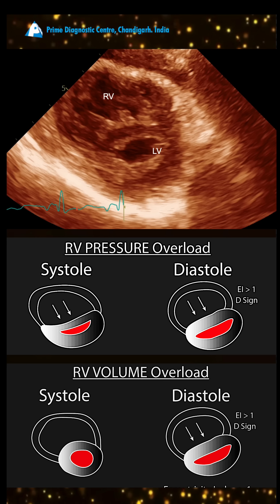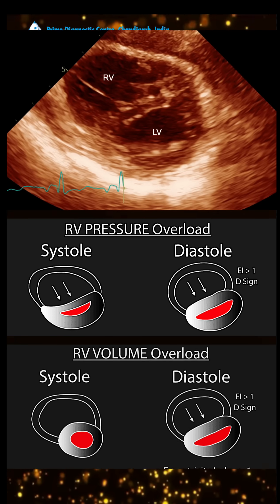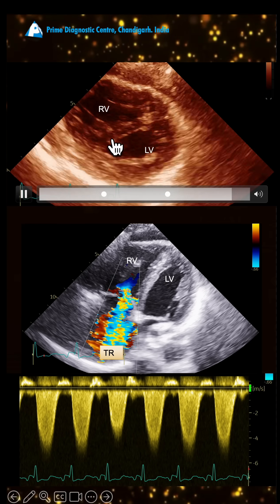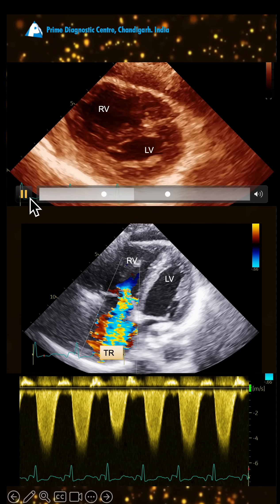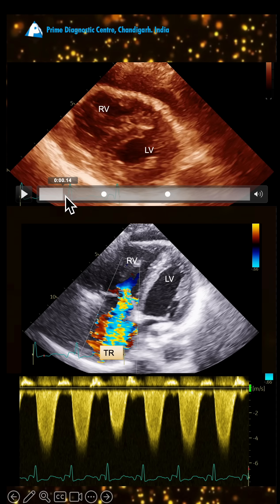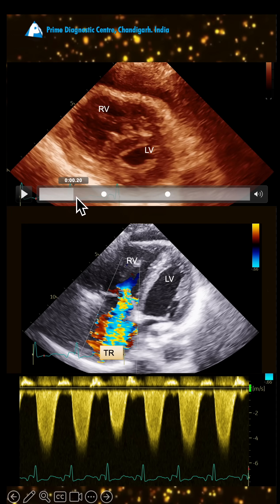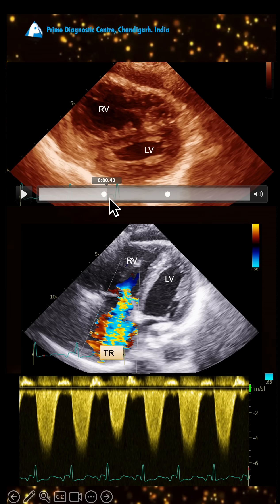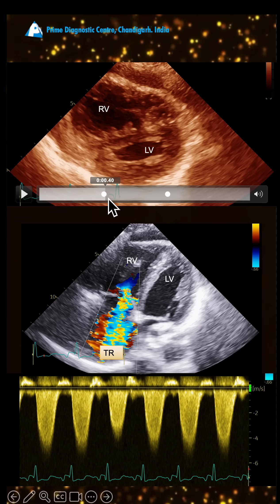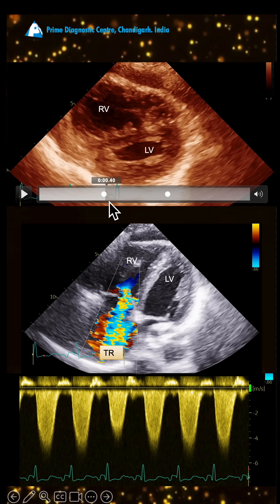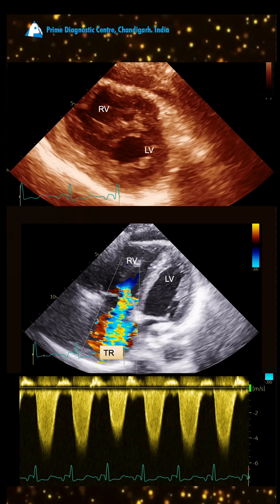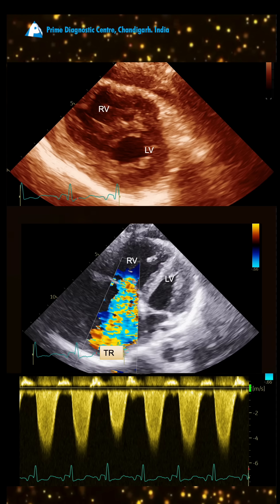Looking at our patient, we assess whether the D sign is happening in systole or diastole. In systole, the LV is not making a D shape, but in diastole there is clear flattening of the interventricular septum. As we go back into systole, it becomes circular again — meaning this patient has volume overload.